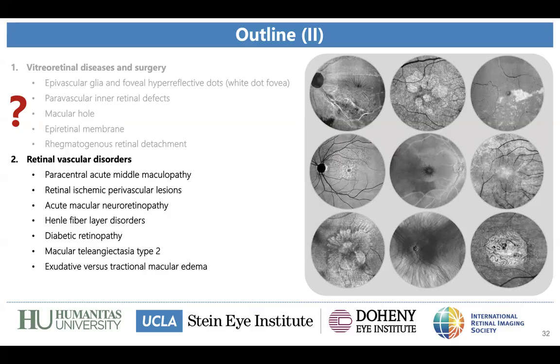Thank you. Well, Alessandro, we are always trying to make it practical for the ophthalmologist, so that tomorrow, the next time he sees a patient, he can apply it in practice. So if you have any insights that might not be in your presentation, any clues or ways to make it easier to take care of patients, feel free to share. Thanks so much. Also, you as well. I mean, I'm learning from you, obviously. So I'm happy to hear that from you as well.